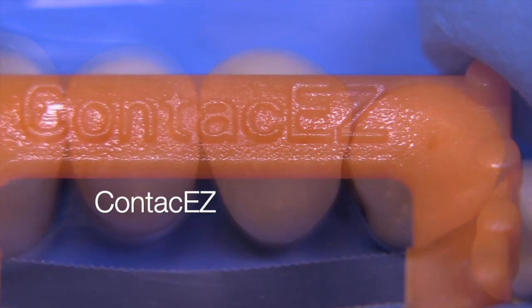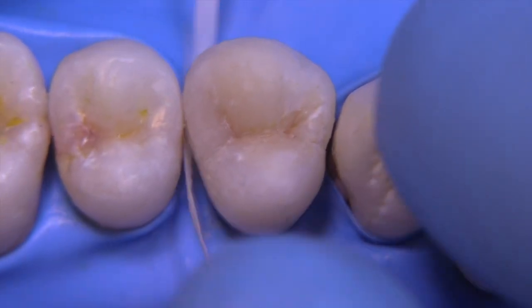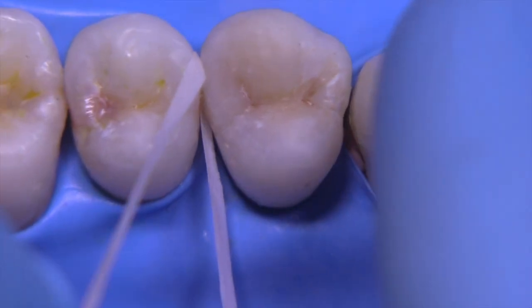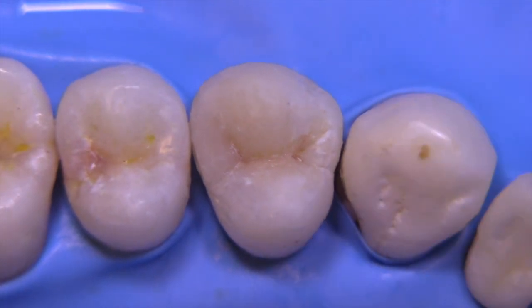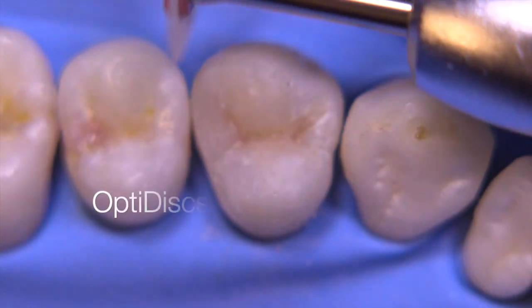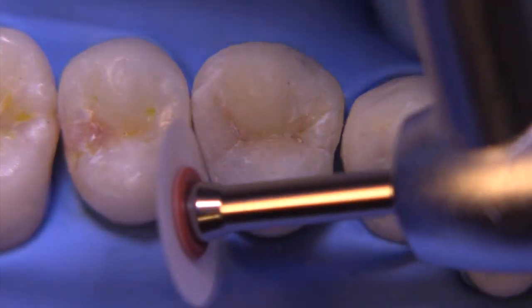I'm going to make sure I can get floss between the teeth, so I'm going to use a contact easy strip to remove any residual bonding material that might have flowed out there. It works pretty well to crack right through the teeth. We check with dental floss, and it has a nice tight snap — so I'm pretty happy with the contact. Then we're going into some basic gross finishing with Opti discs, not going for the high polish yet.